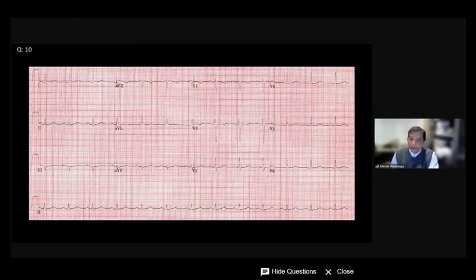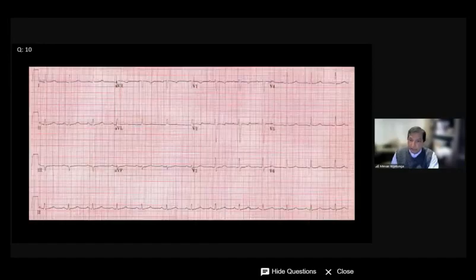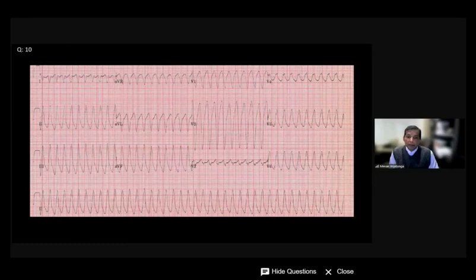But again, I just want to highlight a clinical scenario. The differential diagnosis can be broad here in a young, otherwise healthy patient. But if you have these two ECGs, at least you should be leaning towards one of these four. Is it Wolff-Parkinson-White, arrhythmogenic cardiomyopathy, which is arrhythmogenic right ventricular cardiomyopathy as some people call it, or long QT, or Brugada? Please answer the last question. And please put the answers up, please.